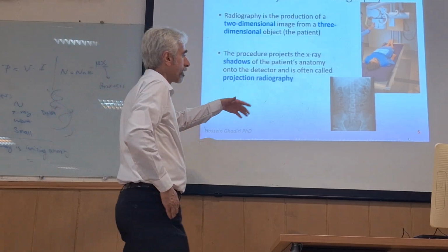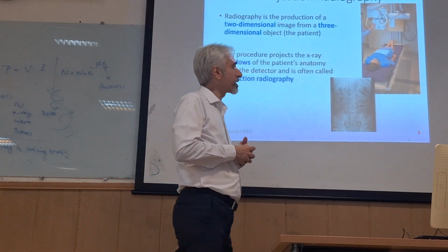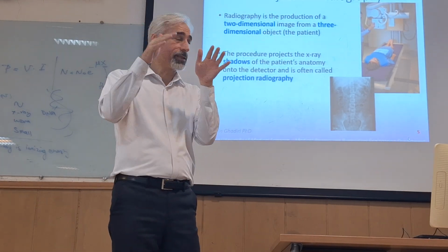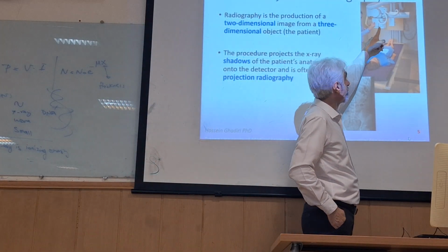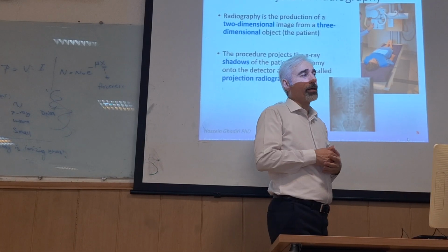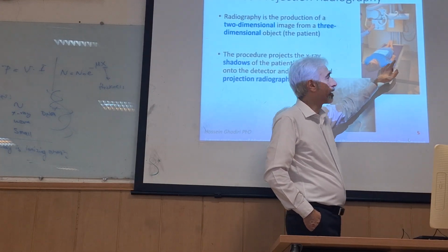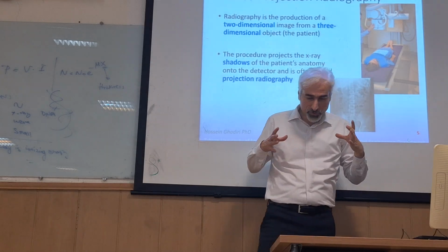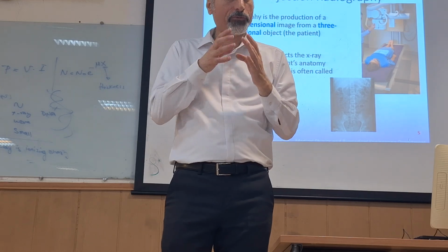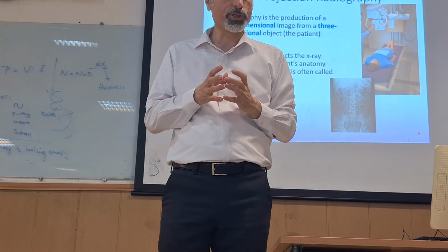There are some tools to do the imaging process more precisely. For example, there is a light lamp inside, on the top after the X-ray source, to show where the X-ray beam will hit the patient's body by using light, because it's very important to minimize the area of X-ray to the patient and precisely adjust the position.